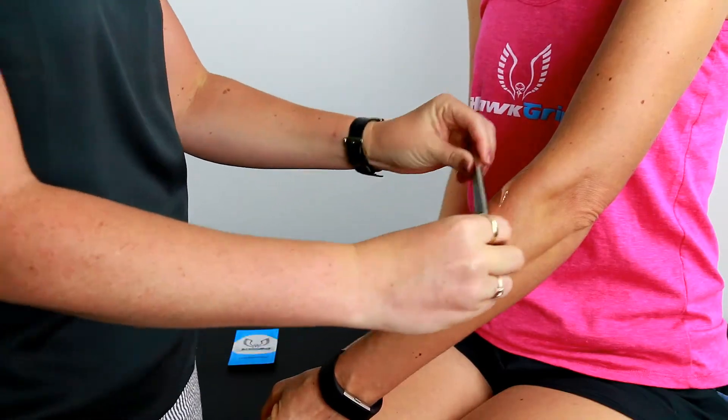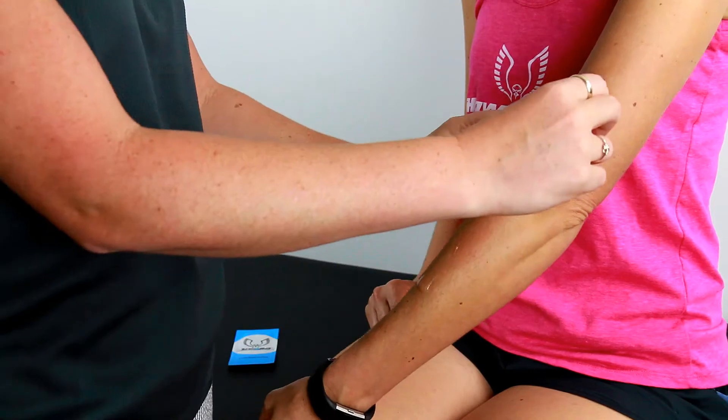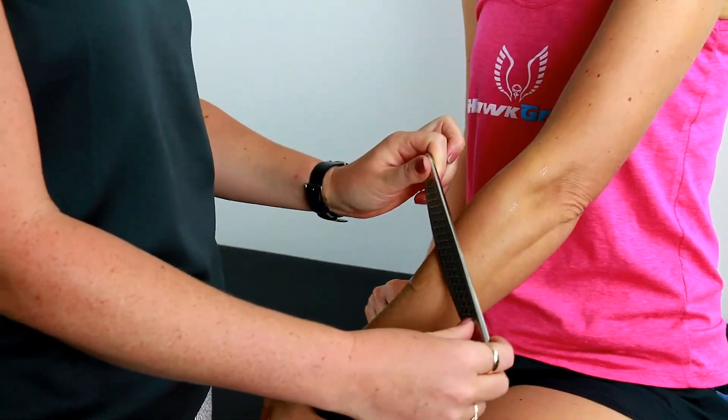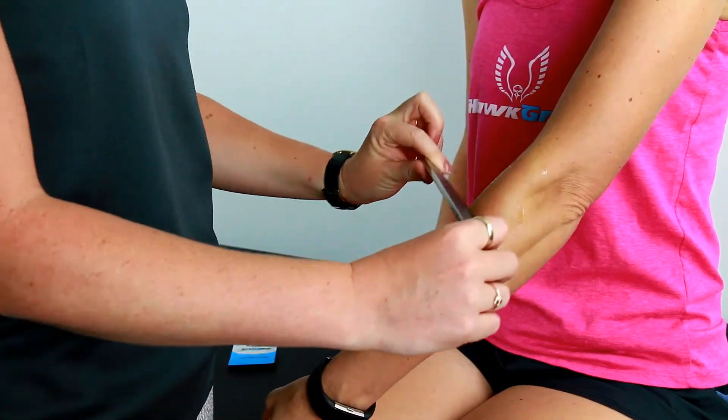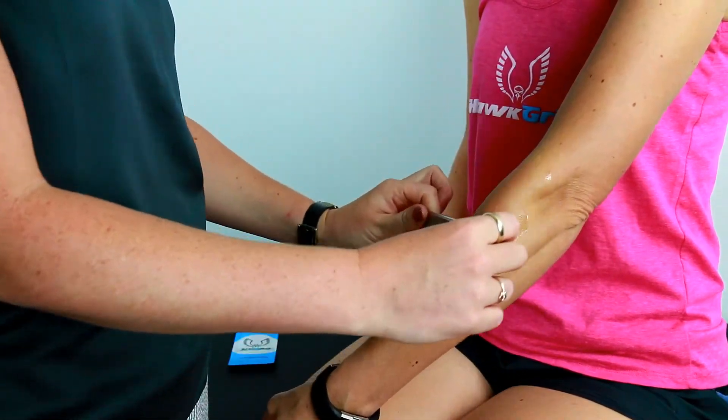Hawk Hydro still has all the same benefits as traditional oil-based emollients. It effectively creates a barrier that reduces friction between the patient's skin and the instrument, and you only need a small amount for the entire treatment.